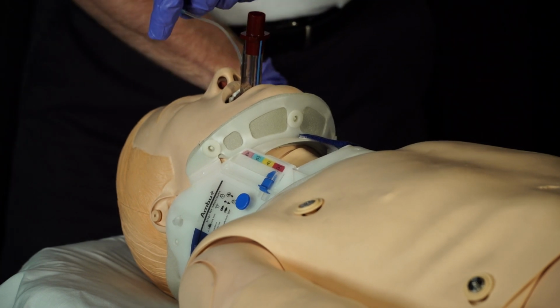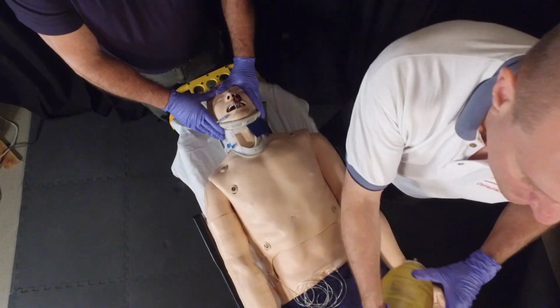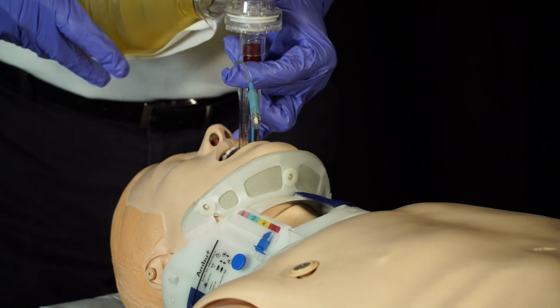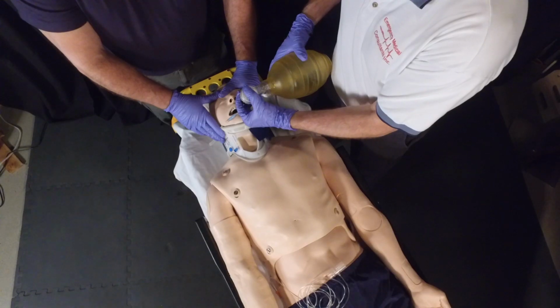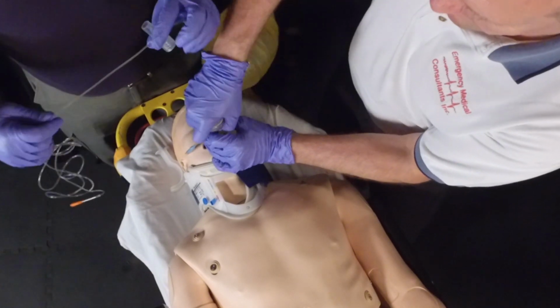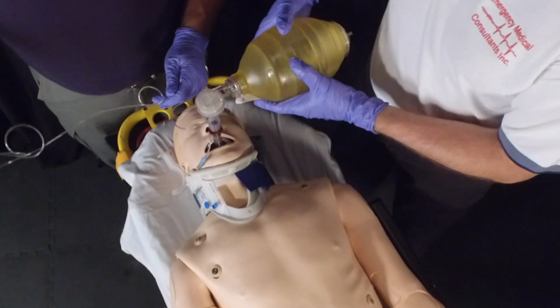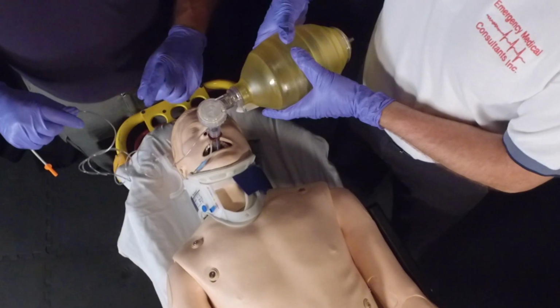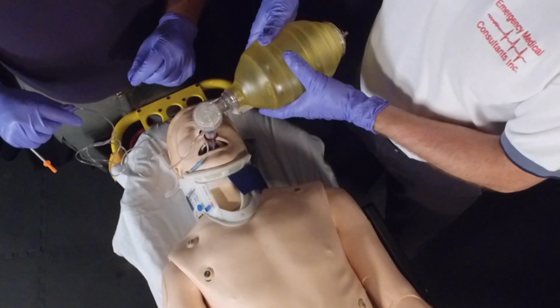The secret to this device is as you ventilate, you must pull back on the tube in order to have the device seat. Sometimes this seems counterintuitive to what we've been trained in, but the device needs to be pulled back. I've seen an inch, inch and a half sometimes in order to get the device to seat. Remember that with either device, you can evaluate end-tidal CO2 just as you would with a tracheal tube. The studies say that they haven't fully evaluated this. However, you should get an end-tidal CO2 reading with any of the paralaryngeal devices you ventilate with as well.